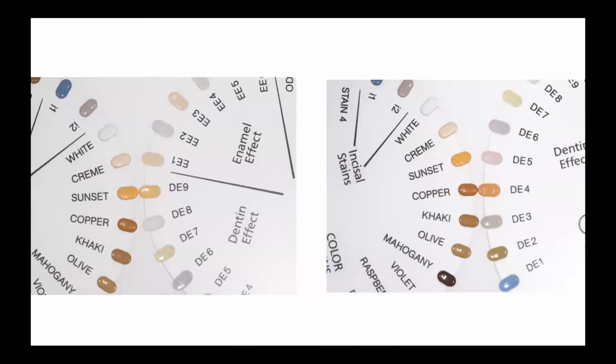And in general, there's a wide selection of stains in every stain system, and every dental technician has a choice of which way to choose, because every effect of the natural tooth can be created both with effect porcelain material or with a proper stain.